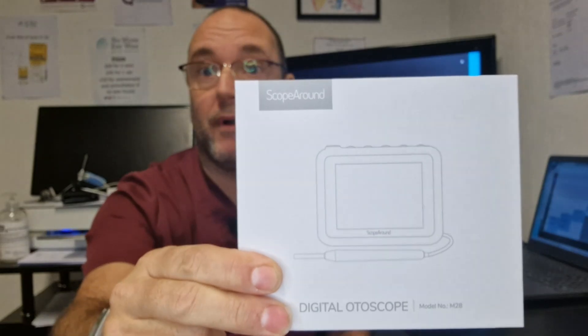Hello there, my name is Richard Ishwood. I'm an ear wax removal specialist nurse. You may know me as the Wax Wizard. And today I am going to show you what I believe is the best ear examination tool there is out there — this digital otoscope from Scope Around.